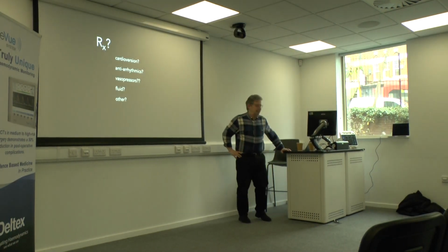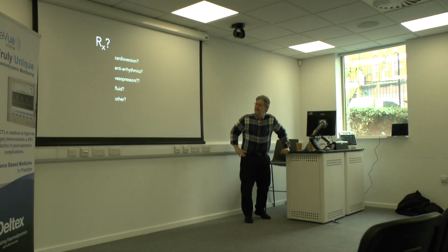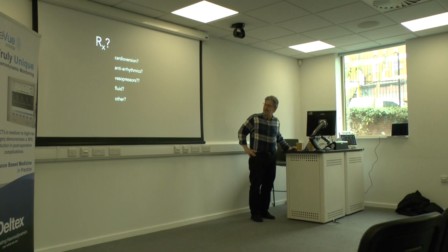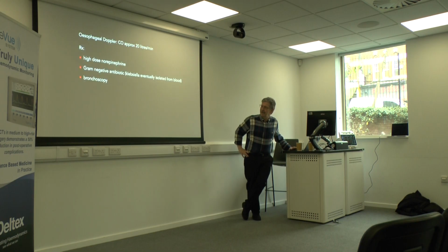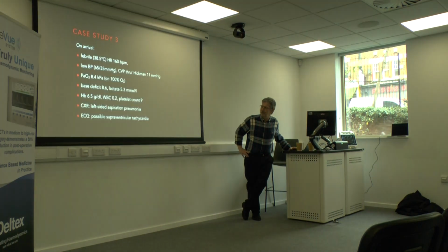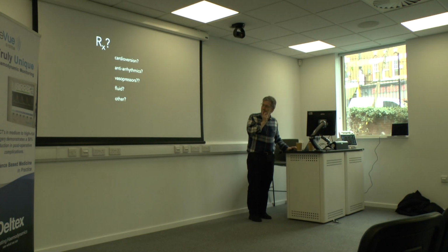Okay, so I think I'll show you the options. It gives you the options of cardioversion, trying an antiarrhythmic, a vasopressor, fluid, or something else. Oh, sorry, I forgot the answer. Sorry, went the wrong way. But without knowing the answer, what would you have done?